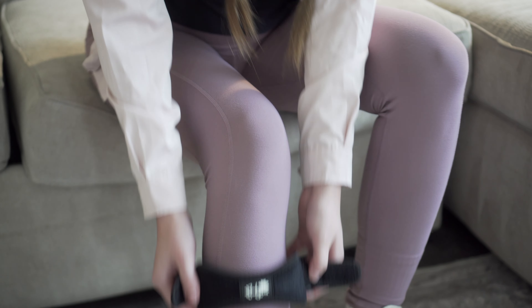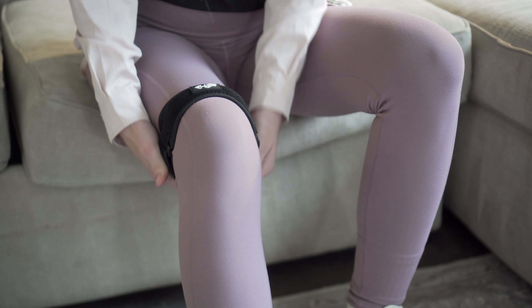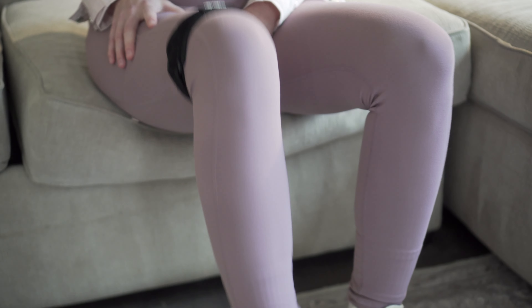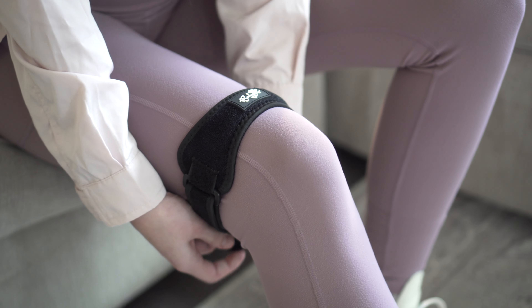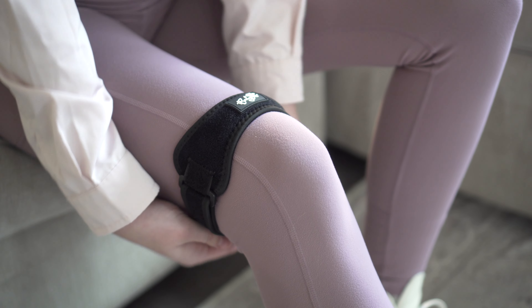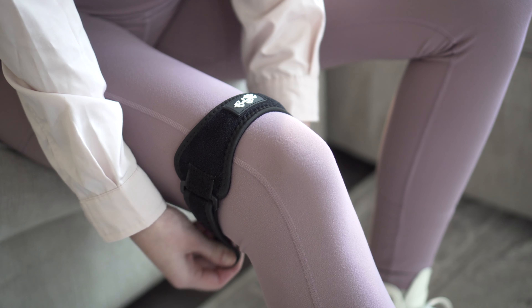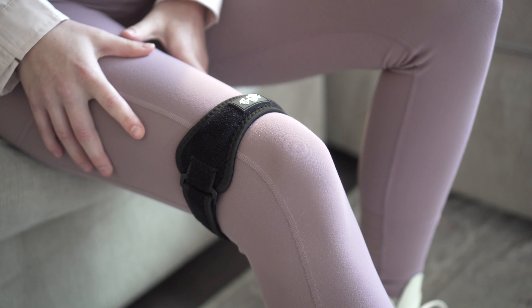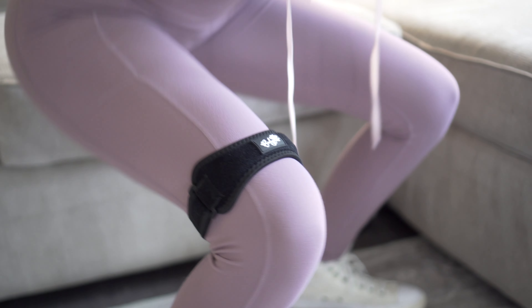To start, slip the strap on and put it up to your knee. The front center with the cushion should be directly under or above the kneecap depending on where you need support. Pull the straps to control the level of pressure until you find the right fit. The strap should fit snugly but comfortably and shouldn't be too tight. To test, you can bend your knees or squat to determine if it's placed properly.